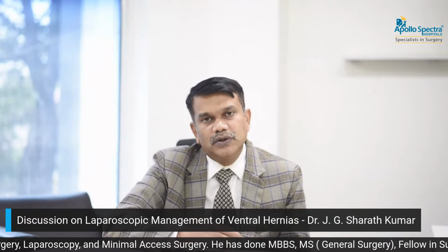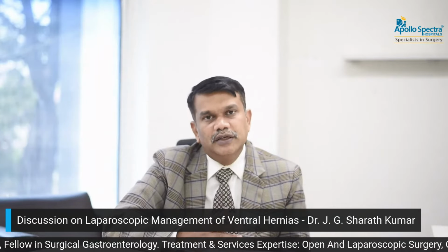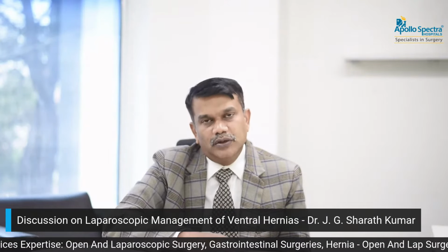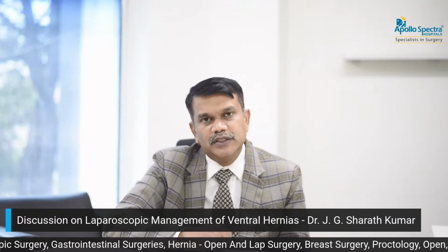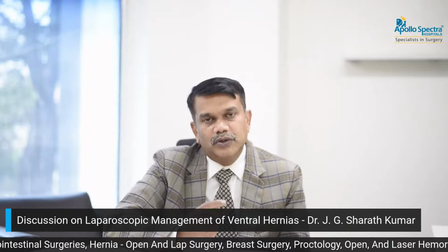Standardly 2 to 4 positions, one at 12 o'clock, 6 o'clock, 3 o'clock, and 9 o'clock, using non-absorbable or delayed absorbable stitches. Following transfascial sutures, the fixation is strengthened by tackers. We usually use absorbable tackers. The technique is called double crown technique. One circle is inside the edges of the mesh, and around the defect one more circle, where we use tackers. That's why it's called double crown technique.